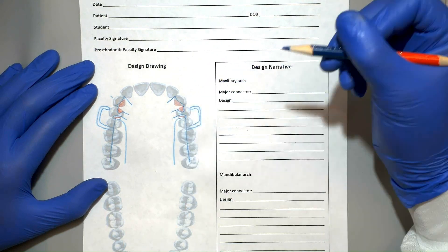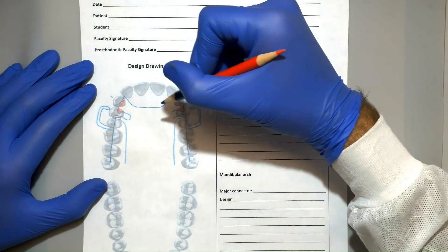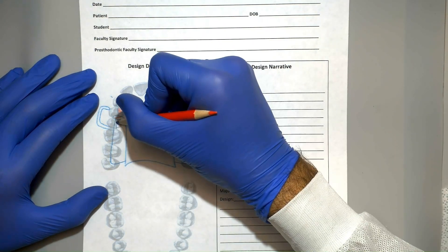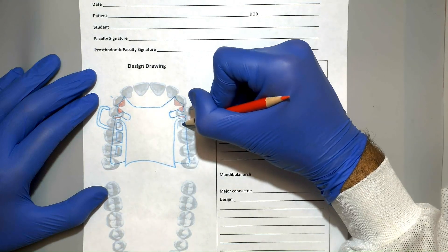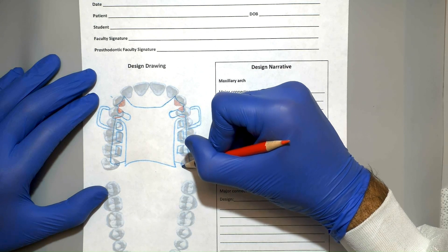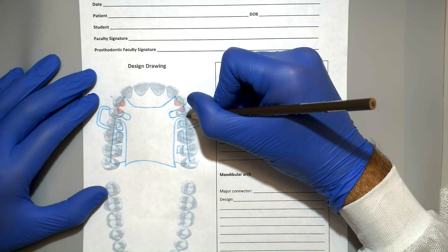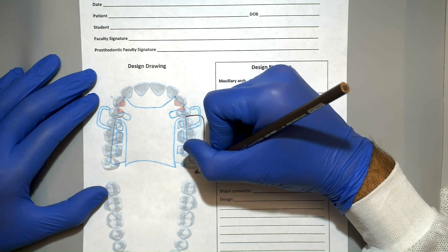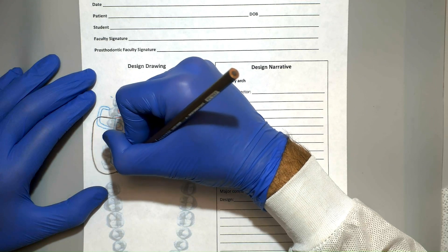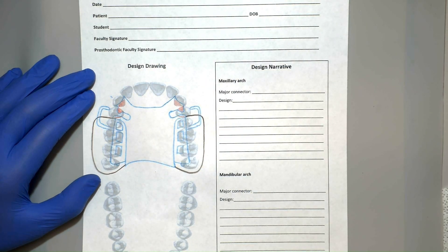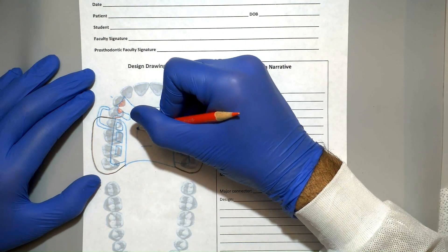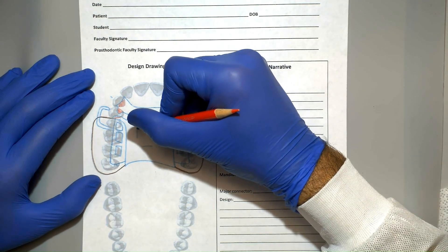To finish off the major connector outline, we're going to connect the remaining lines on the outside of the minor connectors to each other. Now we're going to finish off the lattice by drawing little squares representing openings over each tooth. We'll draw two little tissue stops, and finally we're going to draw the denture base in brown, coming out from the guide plane area, covering the I-bar and going all the way back to the edge of the major connector. We need to make sure that the edge in the back is flush with the major connector outline. Now to finish the AP strap, I'm going to outline the AP strap area with four lines and then connect them together.